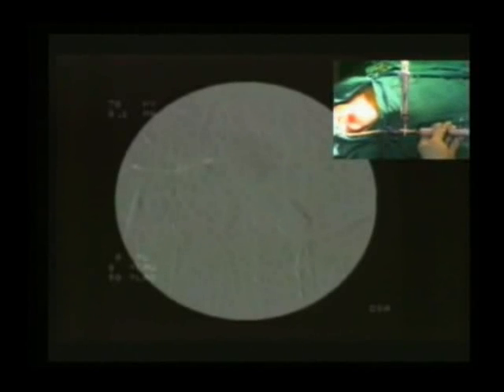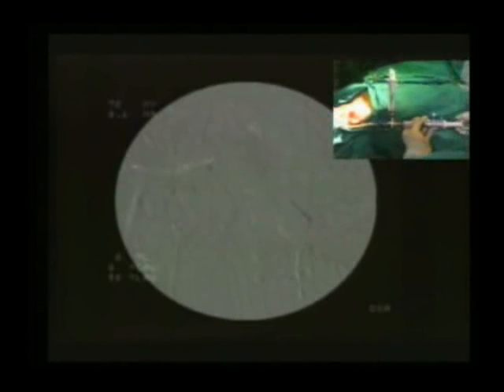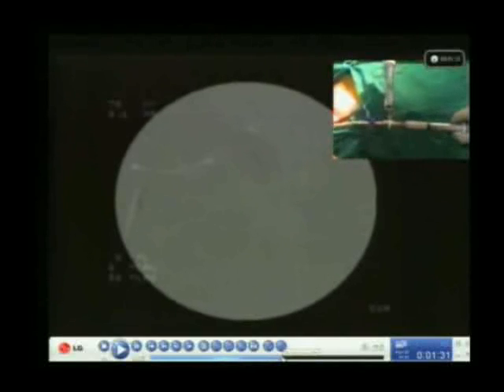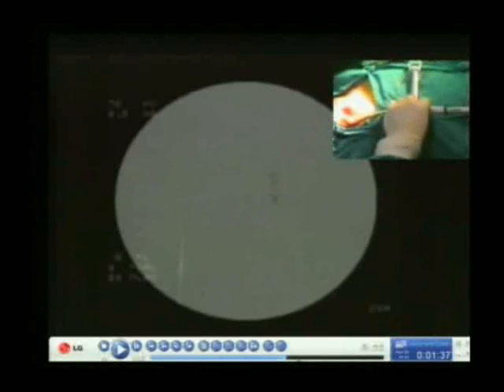Does it really improve the situation? Does it improve your treatment? Formally injected again. It takes some time to put in all the needles, but once it's all in, the rest is very fast. It's only that initial phase. So everything is done as a roadmap, right? So you need a roadmap if you want to use this technique.